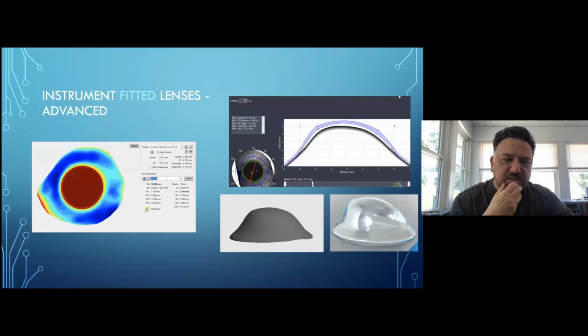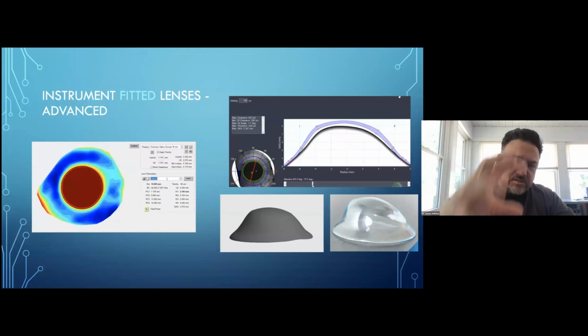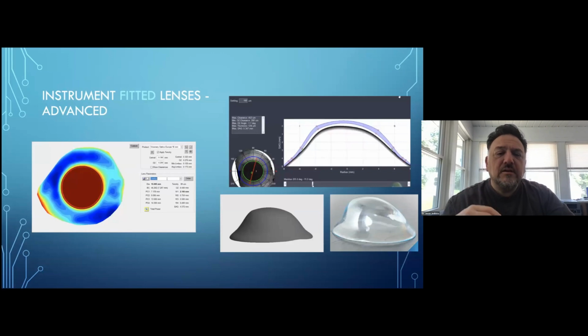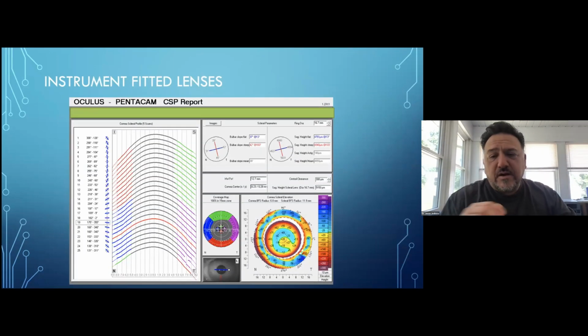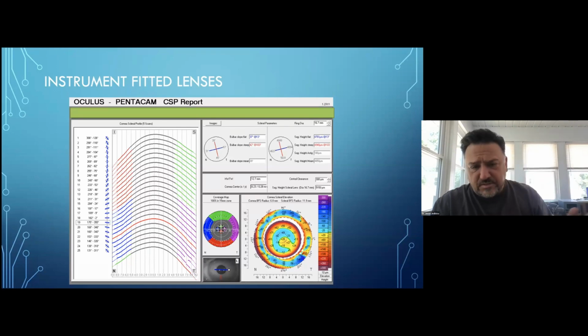And so in those situations, we're using our instrument, as we see in the picture on the left here, our scleral topography, to then input that information into a software program that has very sophisticated capabilities for creating a very customized and free-form lens for our patient. And you can see by the picture on the bottom right, the complexity of lens that you can create using an instrument-based map through these software programs that integrate with them. There are a variety of different instruments that we can use and different softwares we can use. There are some that are integrated with all of the different topographers.